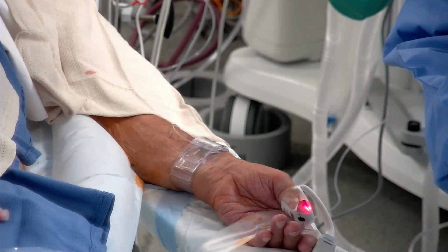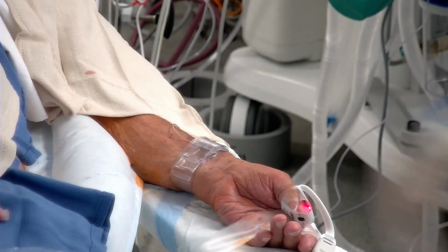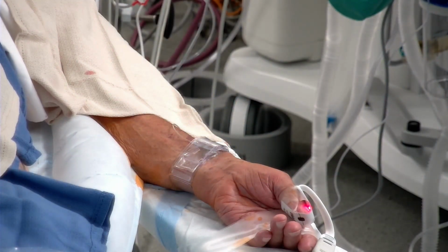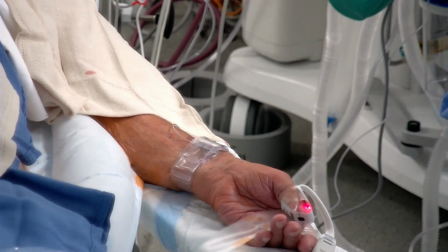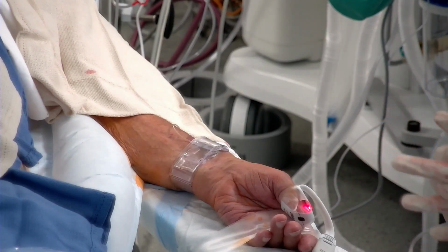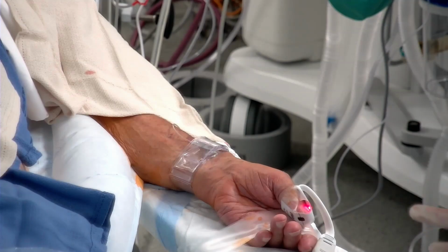This will stay on for about an hour and a half. That gives them enough time to recover in our recovery area, and then we'll take it off slowly. Usually we'll let out a few cc's at a time over a few minutes. Obviously, if it starts to bleed, we'll blow it back up to that 14 cc's and then leave it on for another 30 minutes. I would say the vast majority of patients don't need that extra time, even with the blood thinner or low platelets.